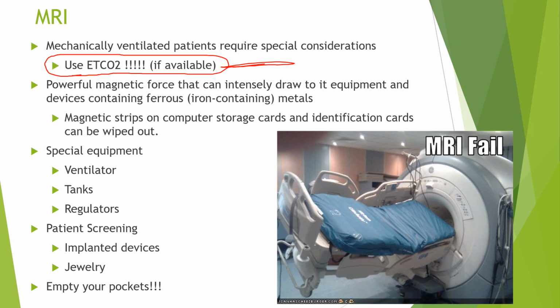All right. Other things you have to be aware of. Don't take any metal things in there with you. They have those little wands that they'll wave all over you to see if there's any metal. And even the MRI e-tanks, there are MRI safe e-tanks, and usually they have this little, I'll use gold here.